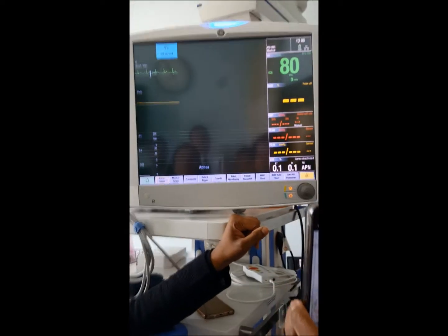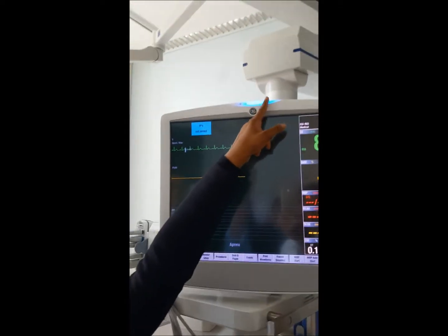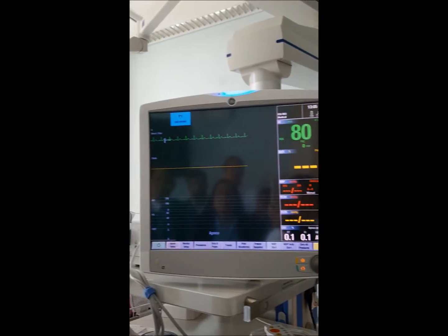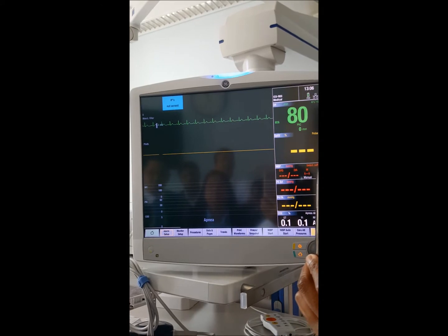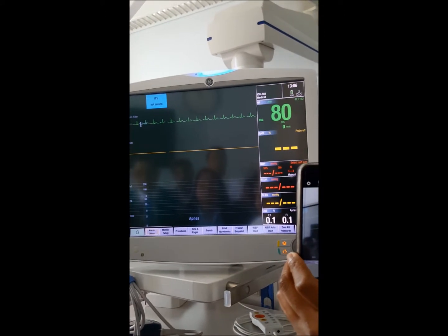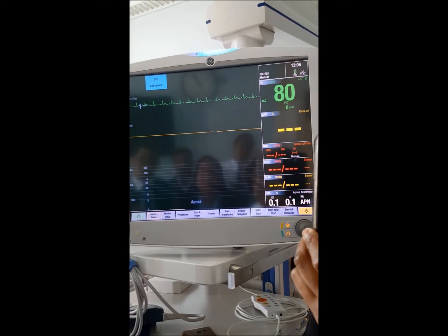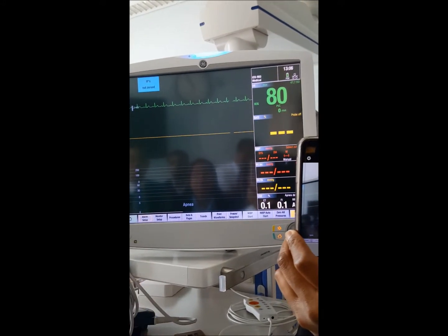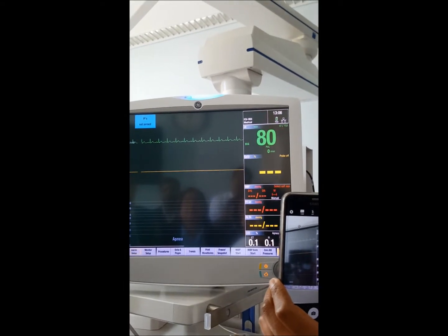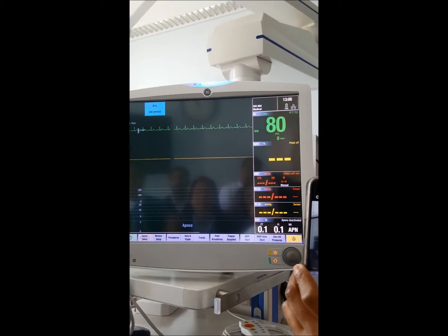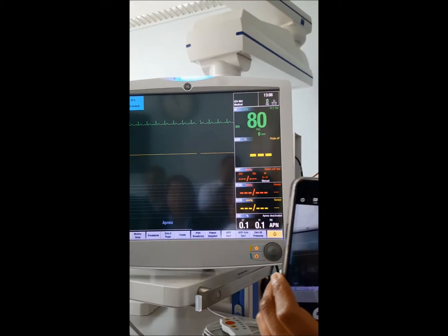There are three indicators for alarms. Number one is light — there are three lights: blue, yellow, and red. Red is critical, orange/yellow is warning, and a message on the screen is just informational. The second indicator is sound, and the third indicator is the message on the screen. These are the three indicators for alarms on the patient monitor.